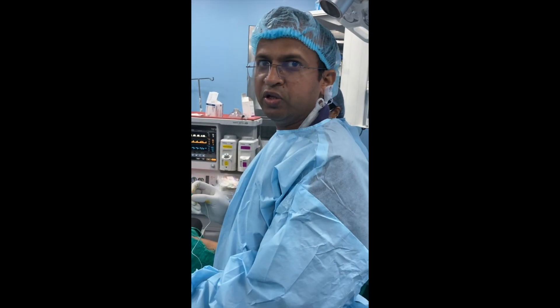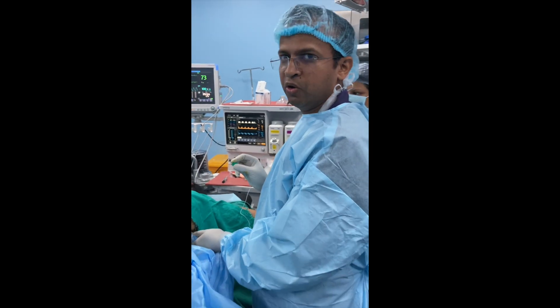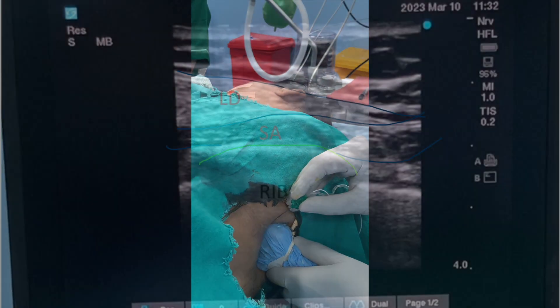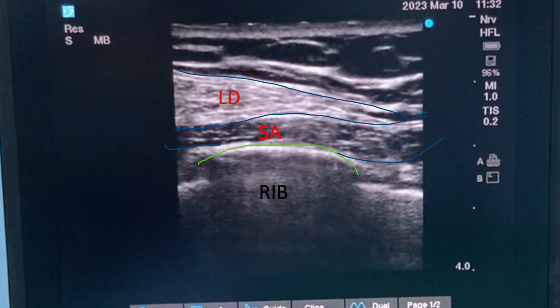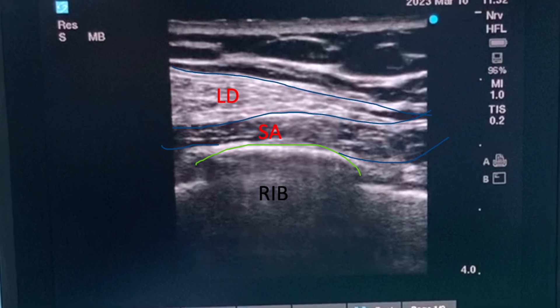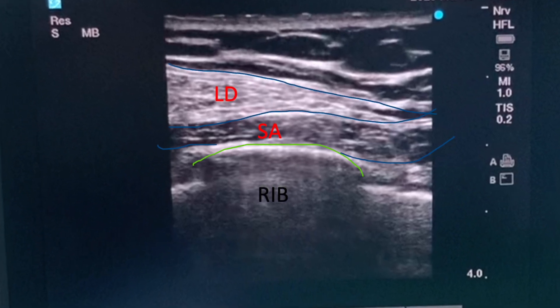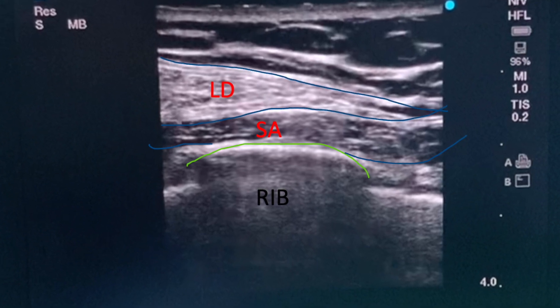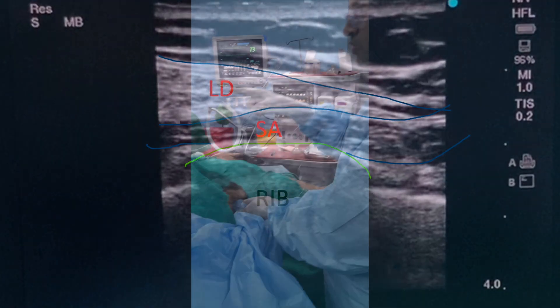Now we are ready for the serratus anterior plane block. Let's see.